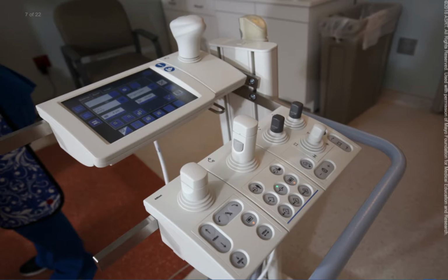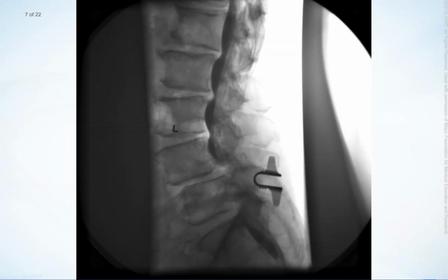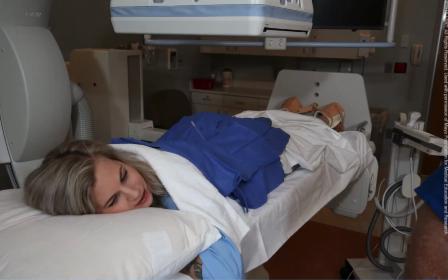LIH allows the user to save the current image on the monitor without using an additional exposure to take a spot image. Images and fluoroscopic field of view, or FOV, are manually collimated as much as possible to limit radiation exposure to the patient. The detector is placed as close to the patient as safely possible to reduce magnification and patient dose.